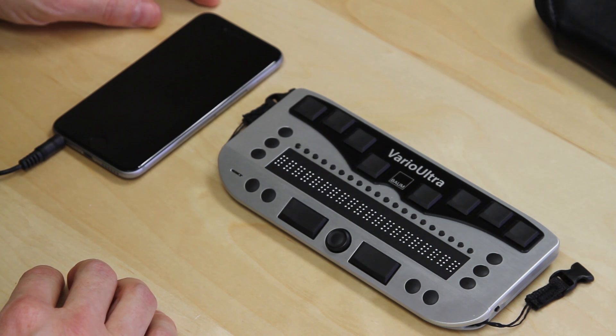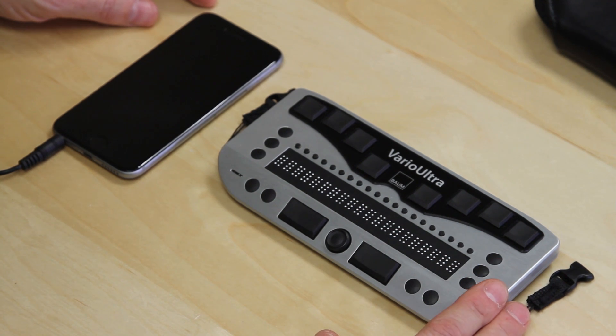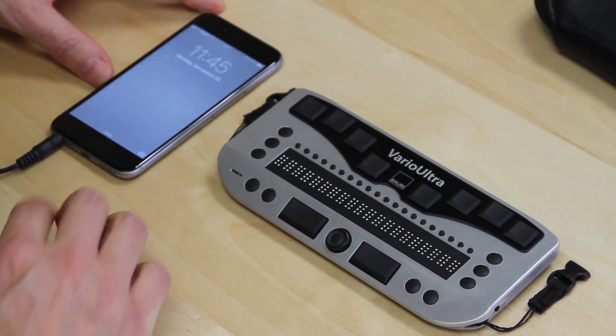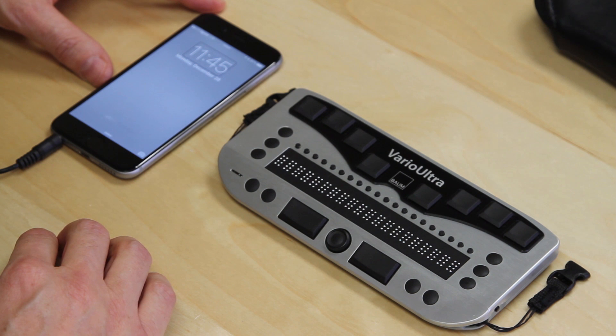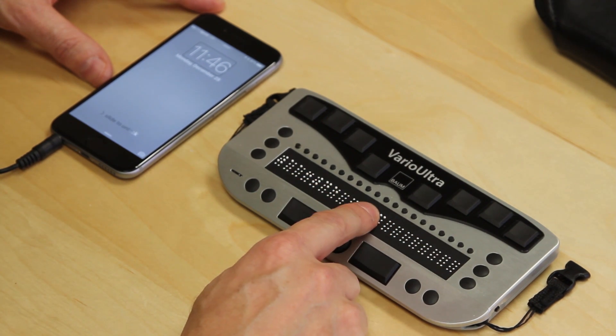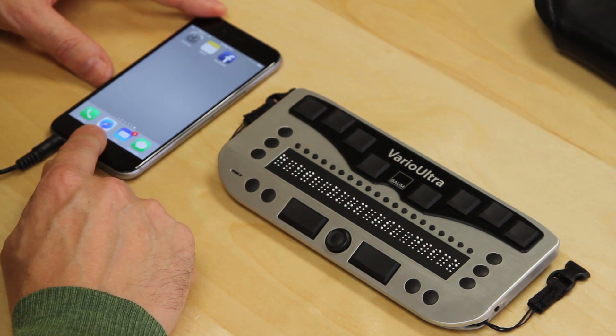Our Vario Ultra 20 and iPhone 6 are paired via Bluetooth and we've already shown it working. Now we're in a situation most of us find ourselves in — we've woken up, we're ready to start our day, and we want to use our phone and Vario Ultra together again. The Vario Ultra is already switched on and in Braille display mode. I'm going to switch the phone on, and within about five seconds the phone is seen by Vario Ultra. The Braille display came to life showing BAUM USA — the name of our phone.